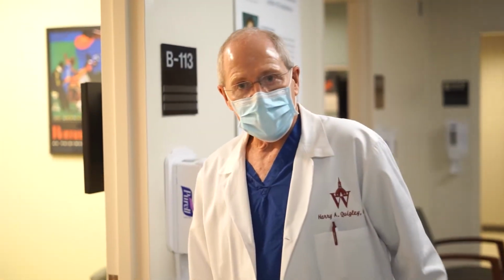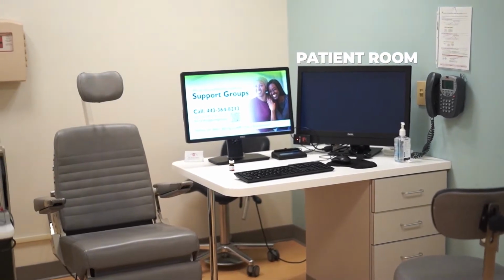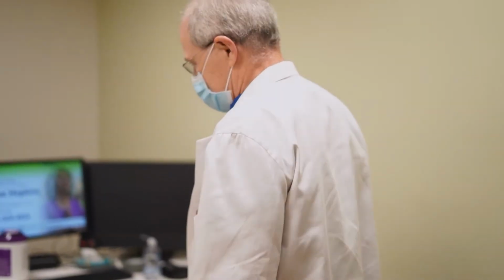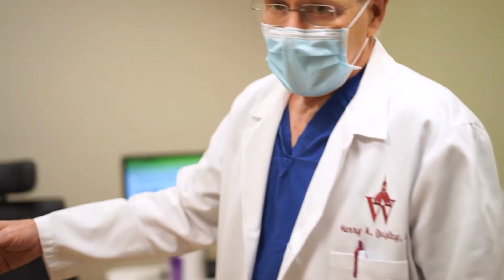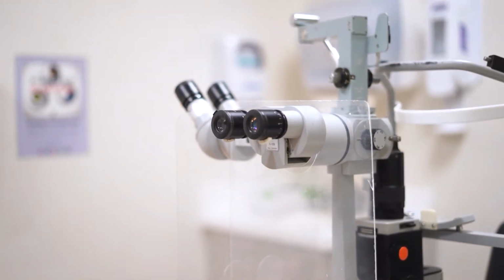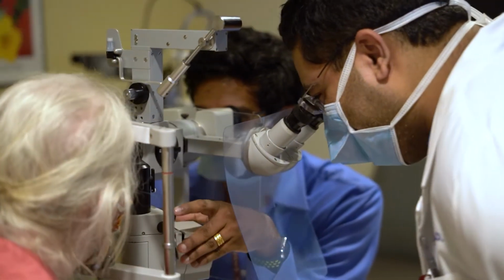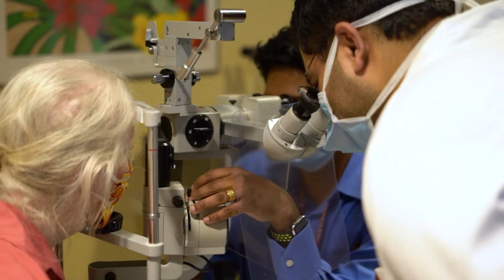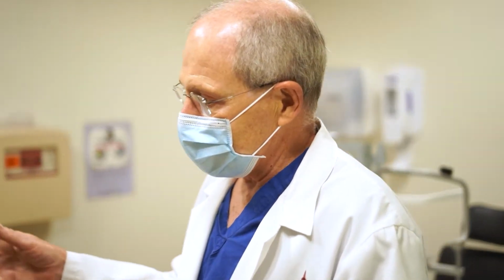We have two main setups for how we see patients. The main rooms are very often set up so that in sitting and talking to the patient, you could be 6 feet away but still be working on the computer. Every one of our examining instruments has, in this area, stereo assistant slit lamps. In that way, when I'm looking gonioscopically or you're looking at an optic disc, I can see in stereo and you can see in stereo. And we've over the years proven that that's really the only way to learn how to do important glaucoma examinations. This room has our YAG laser for both PIs and SLT.